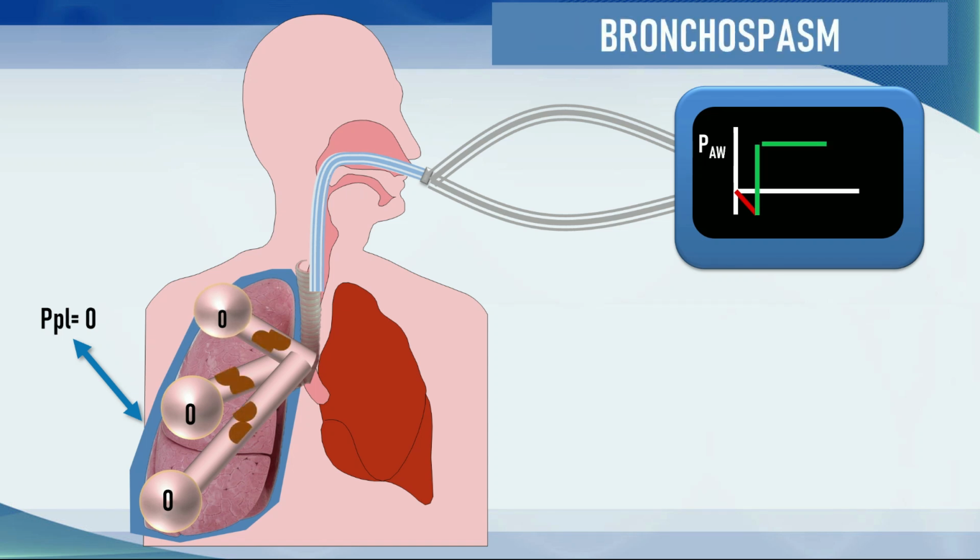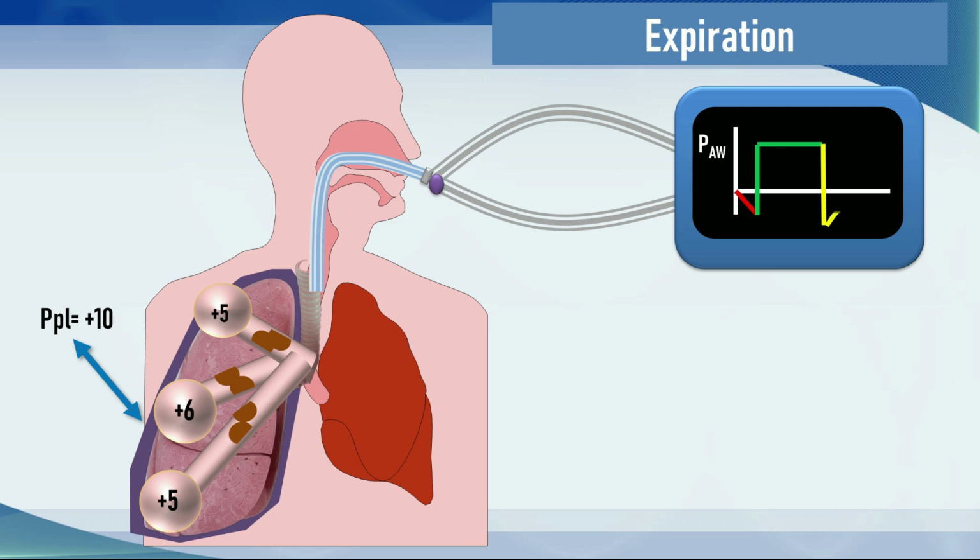However, in the situation where there is dynamic airway compression or airway obstruction due to all kinds of clinical conditions, including bronchospasm, when expiration occurs, the airways are compressed, but because the exit route for gas is partially or fully obstructed, then not all of the gas is expelled at end expiration. This is particularly problematic if the patient is forced to incur a time cycle breath before exhalation is finished. This, of course, is Auto-PEEP or intrinsic PEEP.